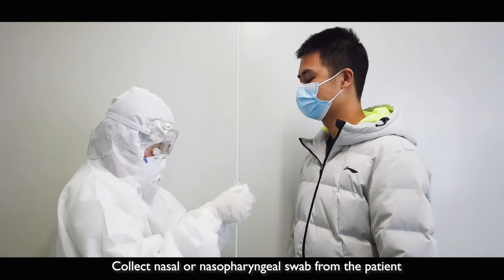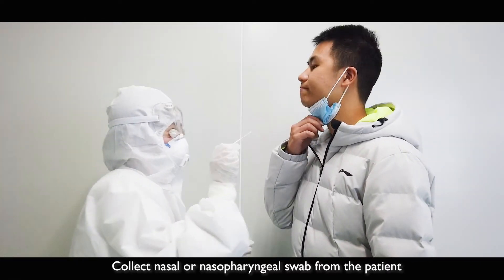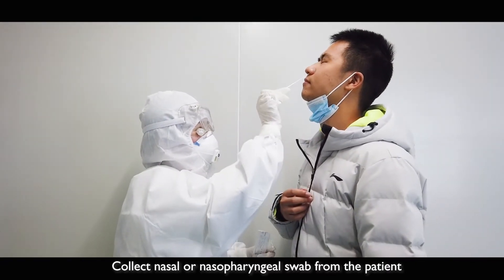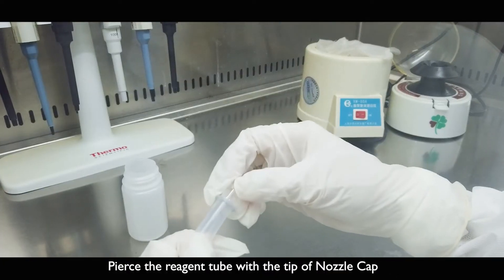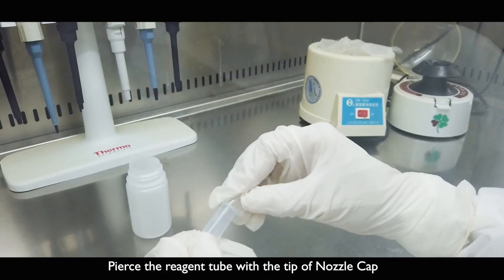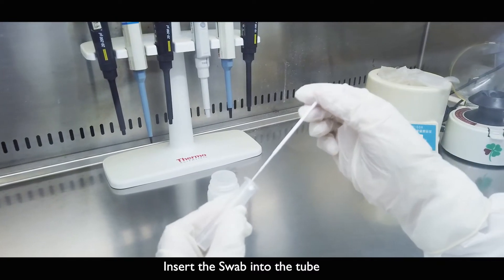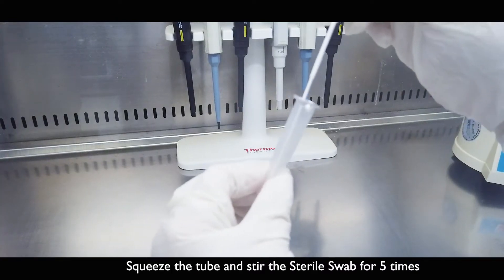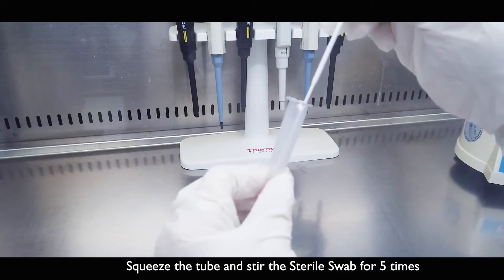Collect nasal or nasopharyngeal swab from the patient. Pierce the reagent tube with the tube nozzle cap. Insert the swab into the tube, squeeze the tube, and stir the swab 5 times.